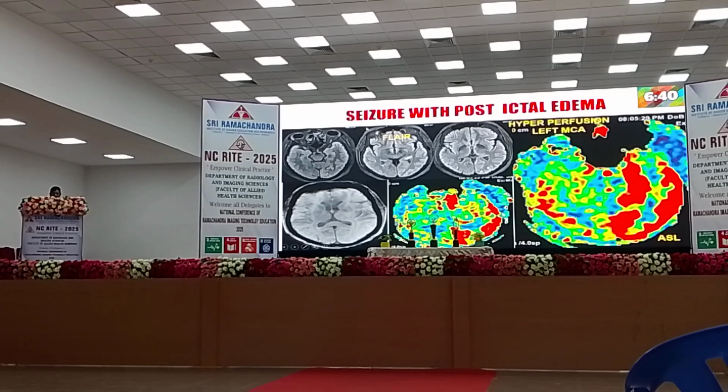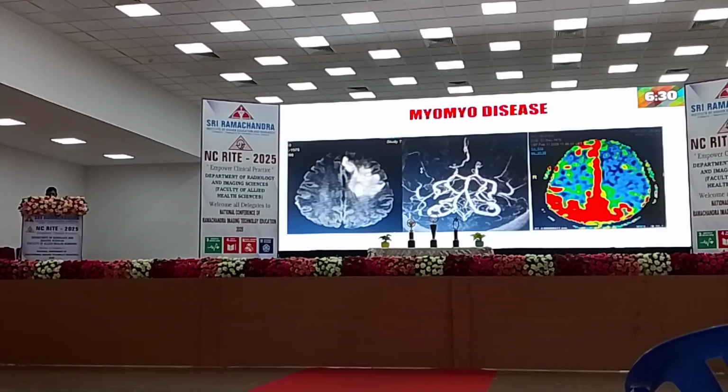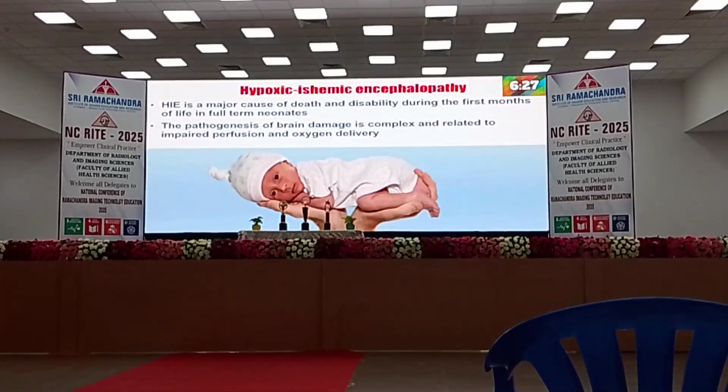Another seizure, you can see this post-ictal edema, it shows hyperperfusion in the left MCA area. So this moyamoya case is also very important, and ASL is very important here. Another case: this is hypoxic ischemic encephalopathy.